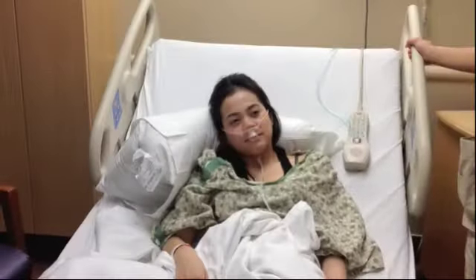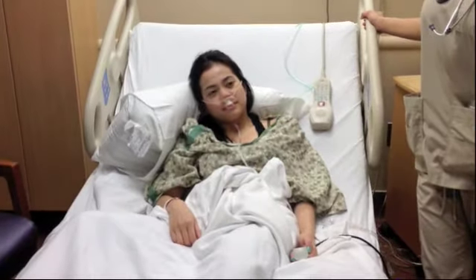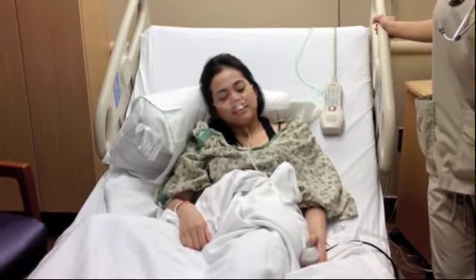The bolus dose is what the patient can control when she presses the PCA button. Once the patient presses this dose, it will give a bolus in order to ensure pain control management.